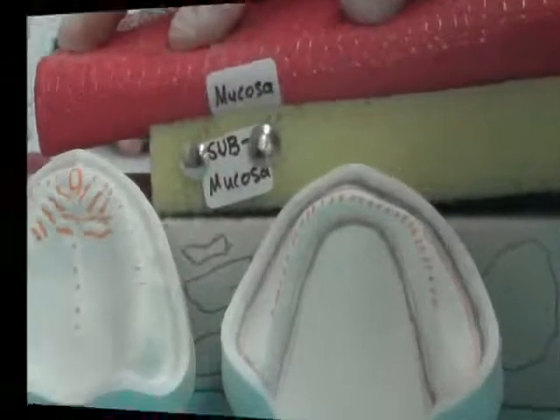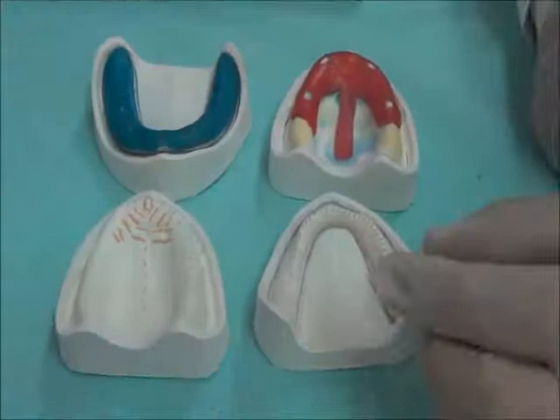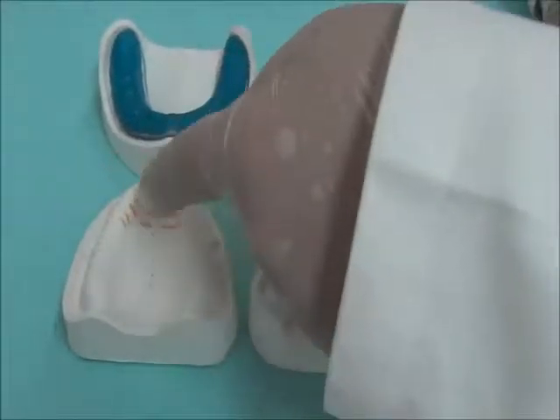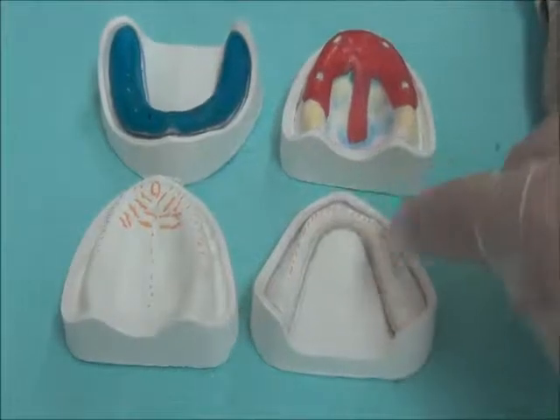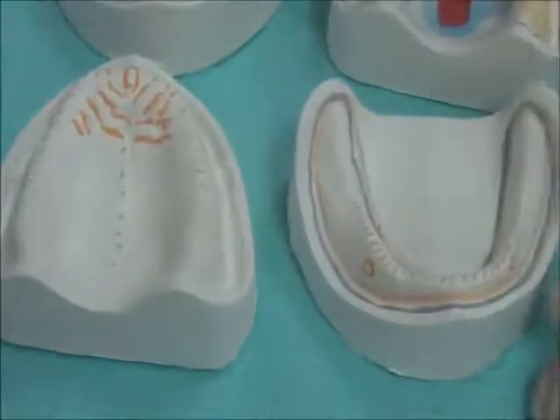So in these areas we relieve, while on all of the slopes of the ridges, we have good compact bone, and we can pressurize as much as possible. So once I understood the different reasons why we need to relieve these areas in orange, these are all the relief areas in the upper and the lower, we now understand why we need to put a spacer.